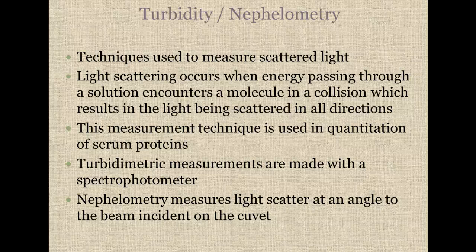The measurement technique is used in the quantitation of serum proteins. A lot of times we use it for things like immunoglobulins. Turbidimetric measurements are made with a spectrophotometer. Nephelometry measures light scatter at an angle to the beam incident on the cuvette.